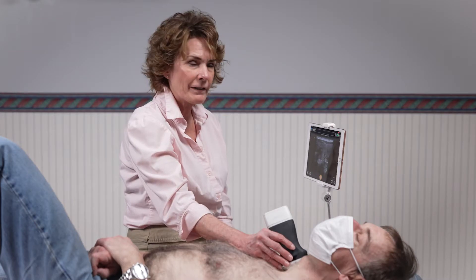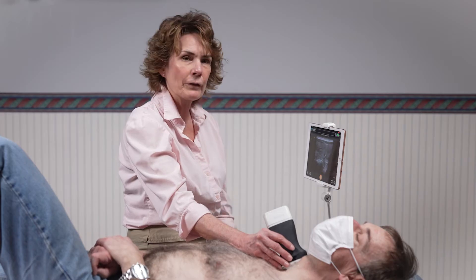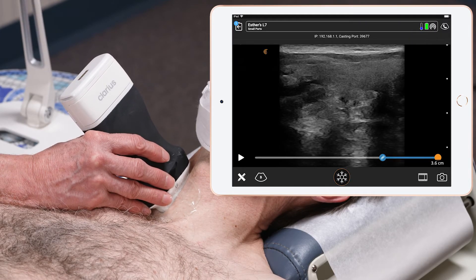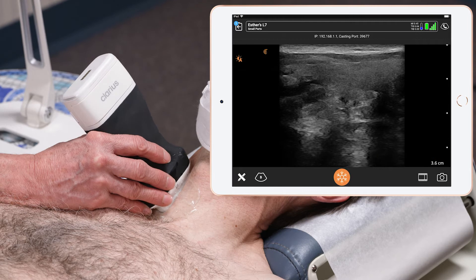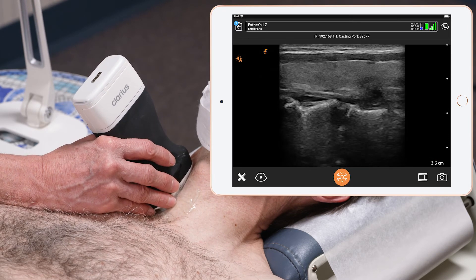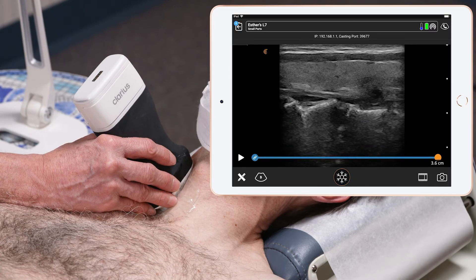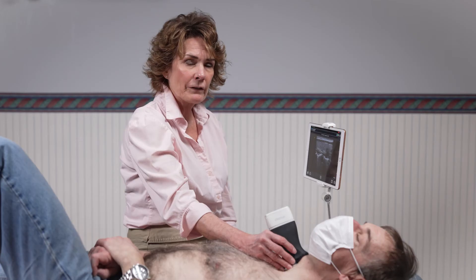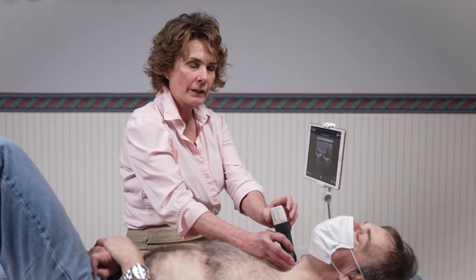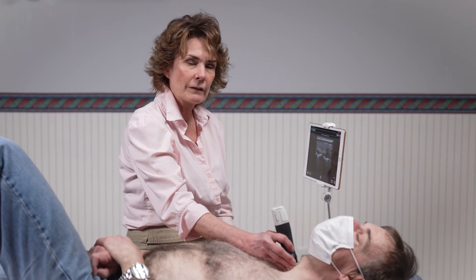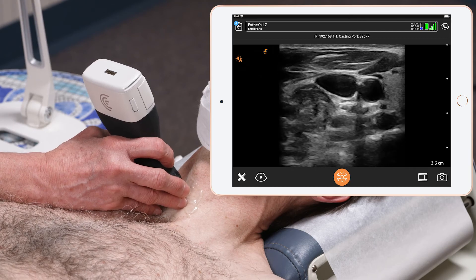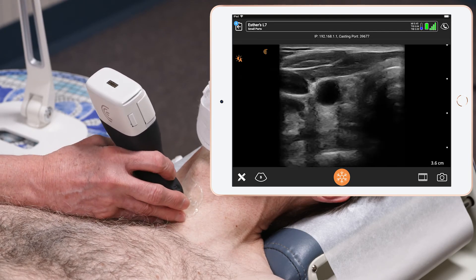Now I fan my scanner medially for the medial portion of the thyroid, take a picture, and then I go to the lateral aspect of the thyroid and take a picture of that as well. To complete the right side, I go to the transverse plane by turning my scanner and I sweep from inferior to superior.